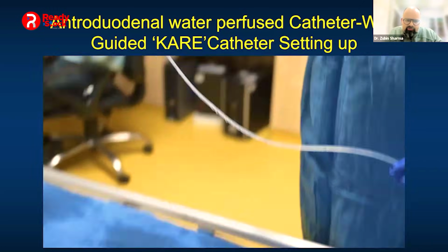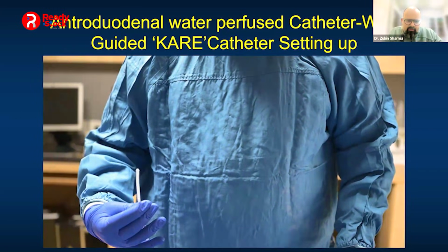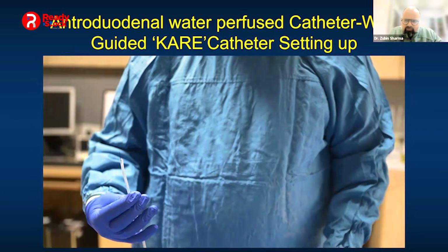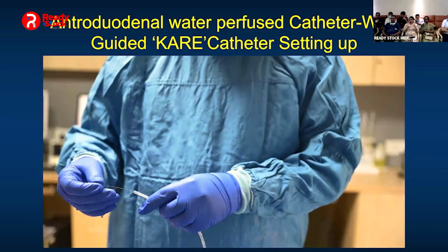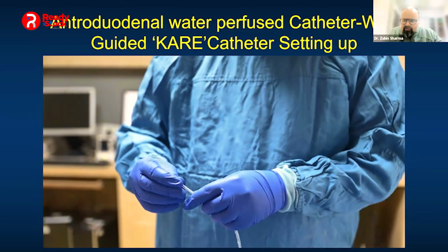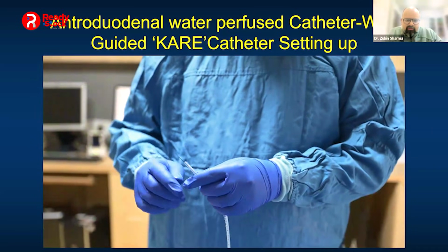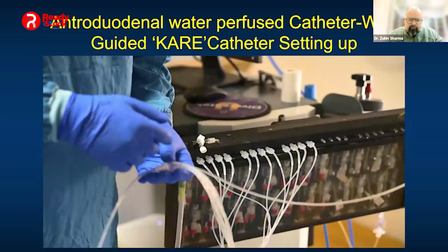In the morning also, I'm sure it must not have taken more than 5-10 minutes to place the catheters. How about it in the morning? Was it easy along with the wire or was it challenging? It was easy. It was okay. So earlier catheters were very floppy and they had 3 weights in the distal end. And it took me at least 2 hours to place those catheters in the beginning when I started doing ADM. But with this wire, it has become easy now.